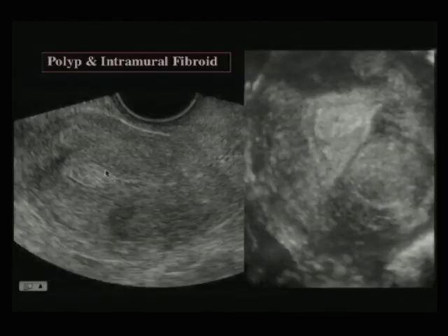Now here is another patient who has a polyp, and you can see on the 2D image that there is a polyp right here that's being measured. This patient also probably has a fibroid right here, but that fibroid is ill-defined, hard to figure out where the margins are so that you can measure it. But if you then take a coronal plane, a reconstructed plane, and here we're also using a thick slice technique, which is simply a technique where instead of just a thin slice, you can stack several slices together and make a thick slice.